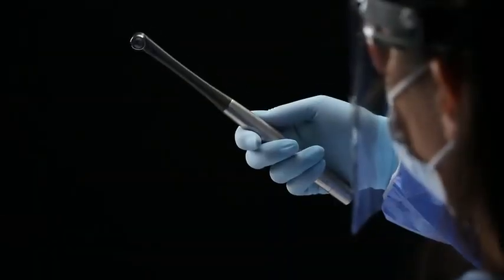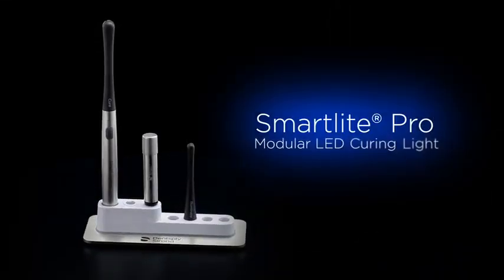Go beyond the ordinary with the modern modular choice in LED curing lights. SmartLight Pro by Dentsply Sirona.